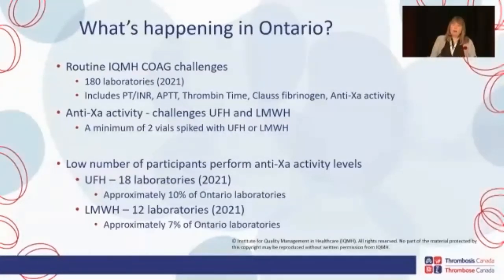As you can see on the bottom of this, very few laboratories offer you anti-10A levels for unfractionated heparin or low molecular weight heparin. Only approximately 10% of Ontario labs will offer you unfractionated heparin anti-10As, and only about 7% of Ontario laboratories offer low molecular weight heparin. So they're not very commonly performed, and these are mostly in our large academic centers.